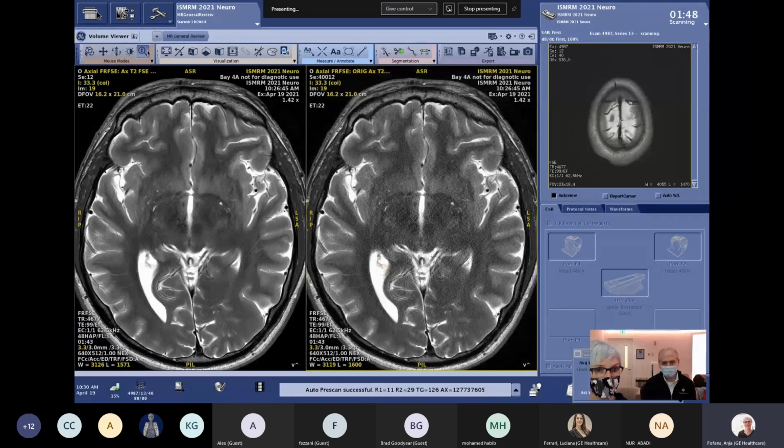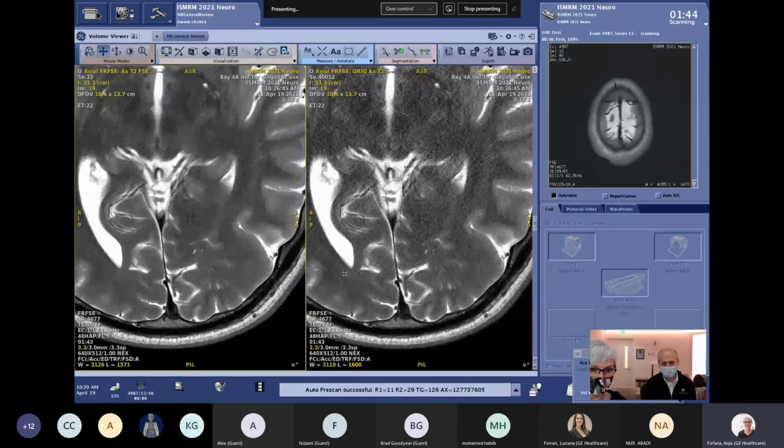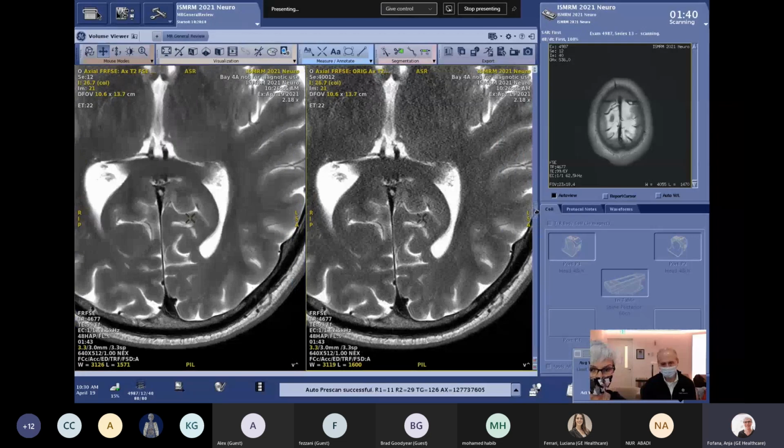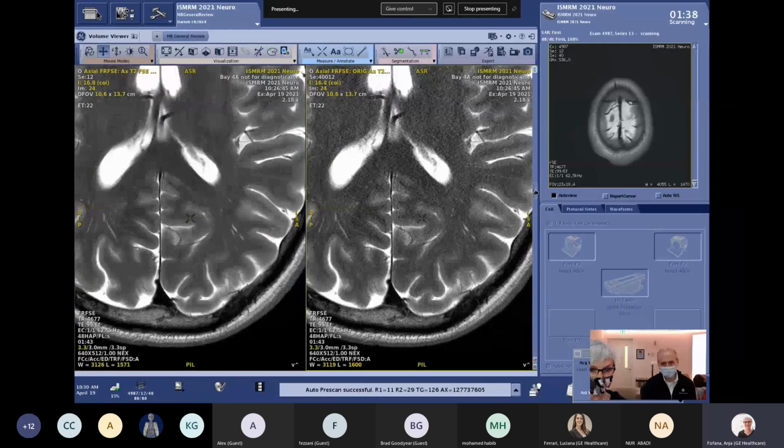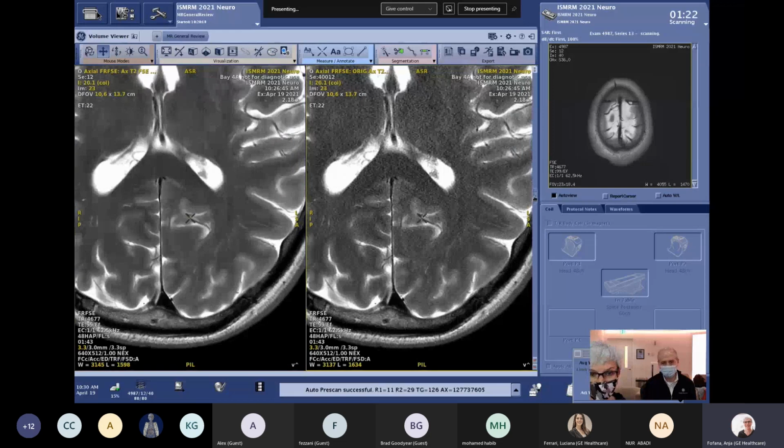And maybe we zoom in here a little bit more as well, and maybe go to some structures in the brain behind. So this is the high resolution scan where we did 3 millimeter slice thicknesses through the entire brain. You can see how nice the detail is everywhere. And on the right hand side, the detail is still there, but it's overlaid with some noise, so it's harder to look at these images, right? Yeah.